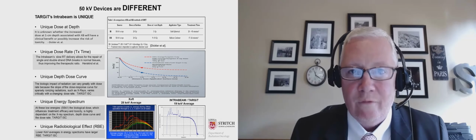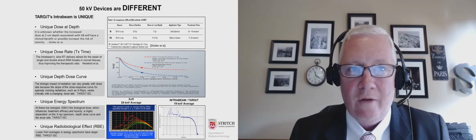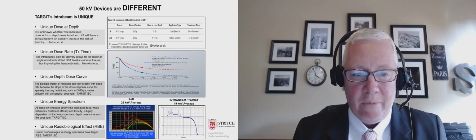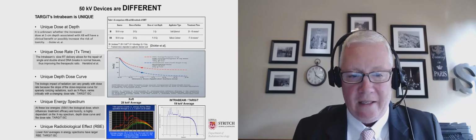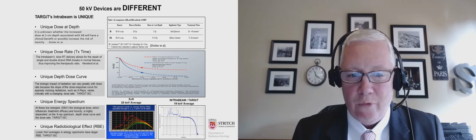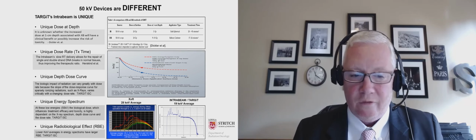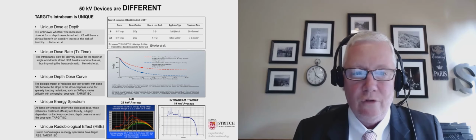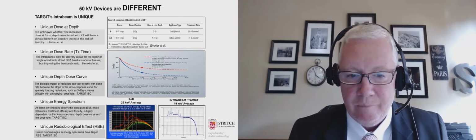So I would say there's 2 main 50 kilovoltage machines. There's the Intrabeam Zeiss machine and there's the Xoft machine. They are different. So I don't think we know if the way of delivering with Xoft is as good, better, or worse. There's just not a lot of big randomized studies that we'll talk about. And again, I won't belabor this point, but the physics of the 2 beams are different. So it's unclear if the outcomes would be exactly the same between the two treatments.